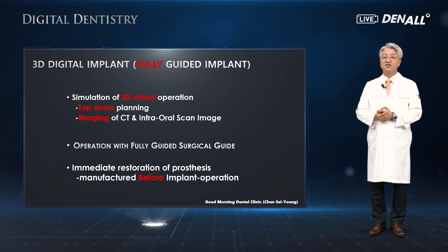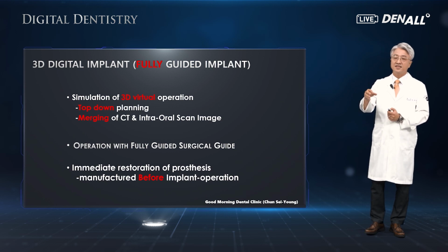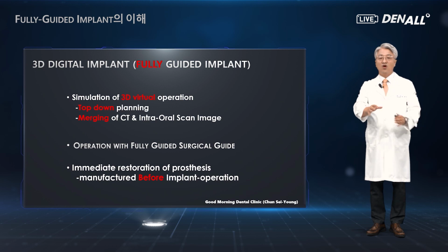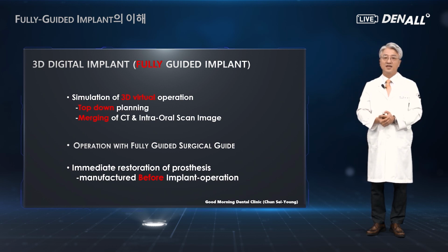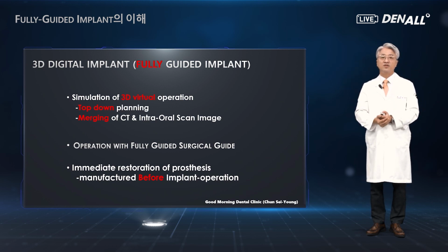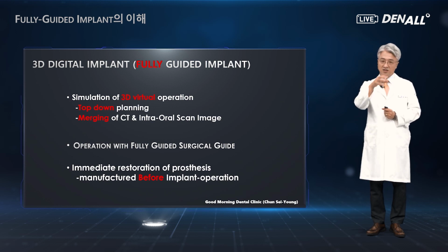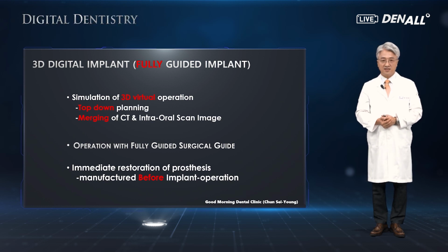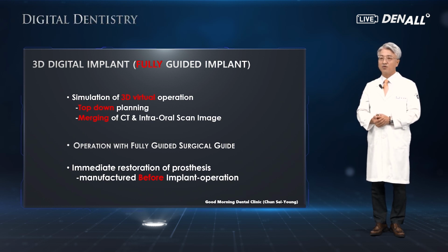And lastly, as I explained before, before implant is placed in a patient, pre-designed data is used to prefabricate prosthesis, temporary or abutment to do immediate placement.